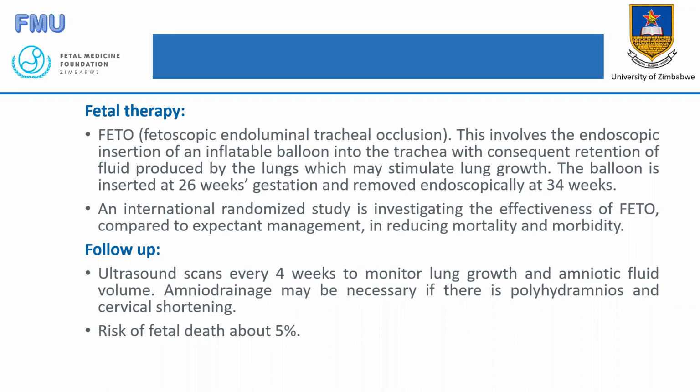So how it works is that through endoscopy, this is an in utero procedure when the baby is inside. An inflatable balloon is put inside the trachea, so that the lungs can retain some fluid and expand and stimulate the growth. The balloon is inserted around 26 weeks and removed endoscopically around 34 weeks.